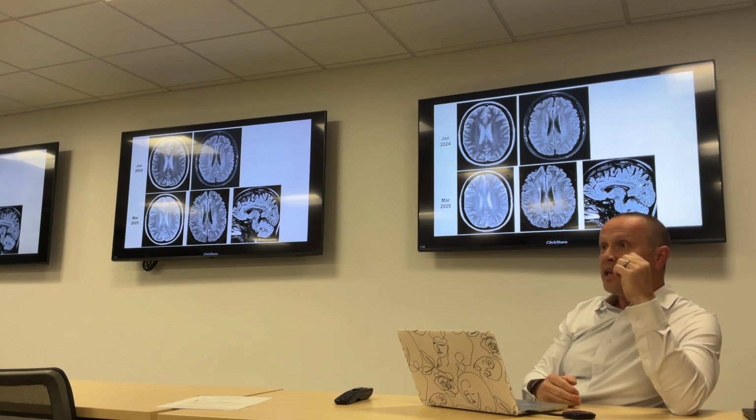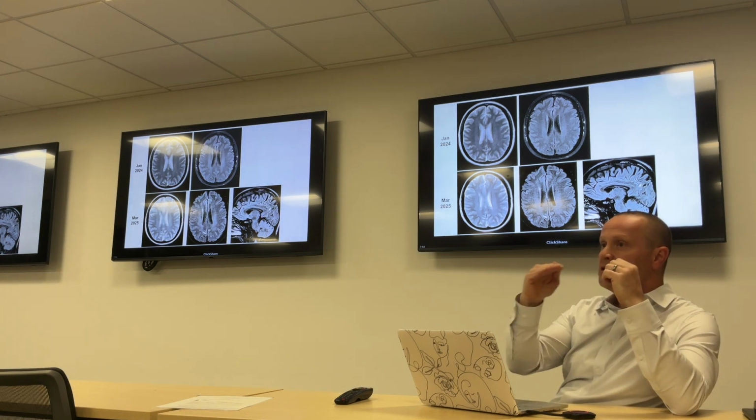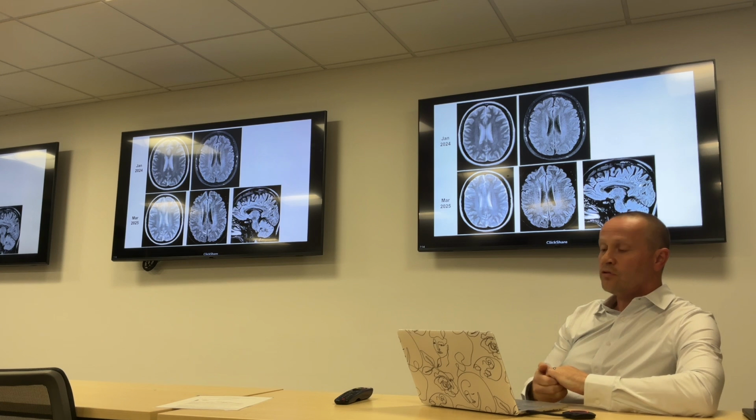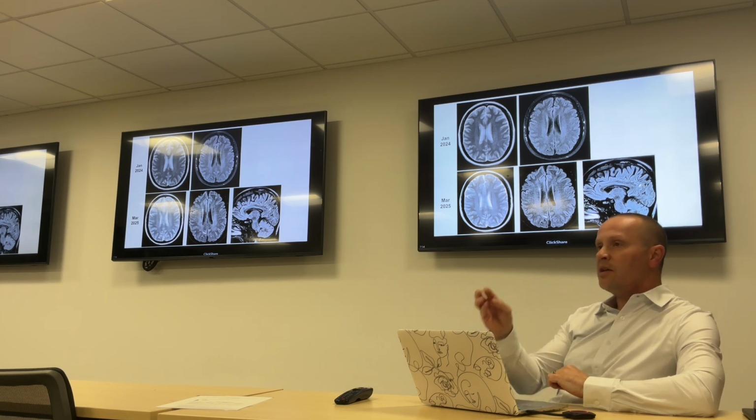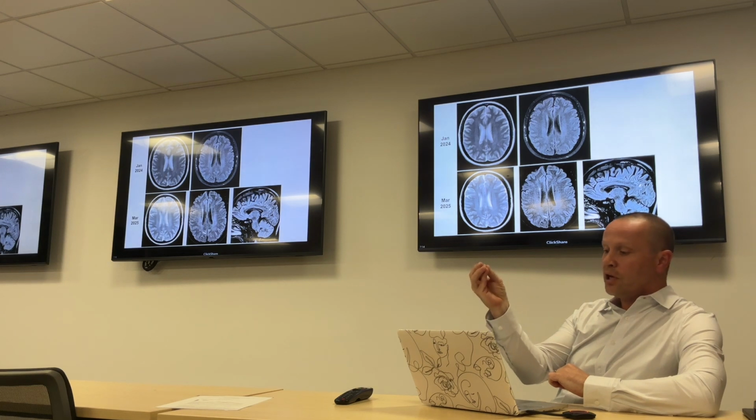So image slices make a difference, and slice position makes a difference as well. That's totally true. And you can see here on this sagittal FLAIR sequence, this is just off midline. This is probably a slice going right through the brain, like right in this plane. So it's cutting right through the lesion, and that's why it shows up right here. If we were one slice to the side, it might just show a fainter little blush of brightness.